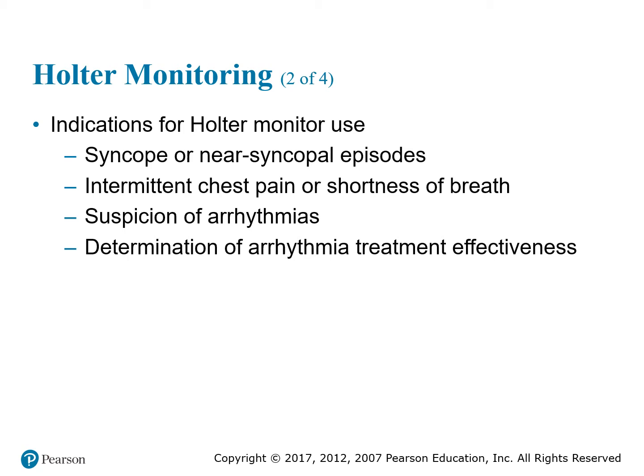These are some indications for Holter monitor use. A patient might experience syncope or near syncope episodes, which basically are fainting spells, which can be caused by an arrhythmia. That gives evidence for a Holter monitor to be placed on the patient, because this is something that a normal routine EKG wouldn't pick up. This is something the patient experiences when they're moving around on a daily basis.